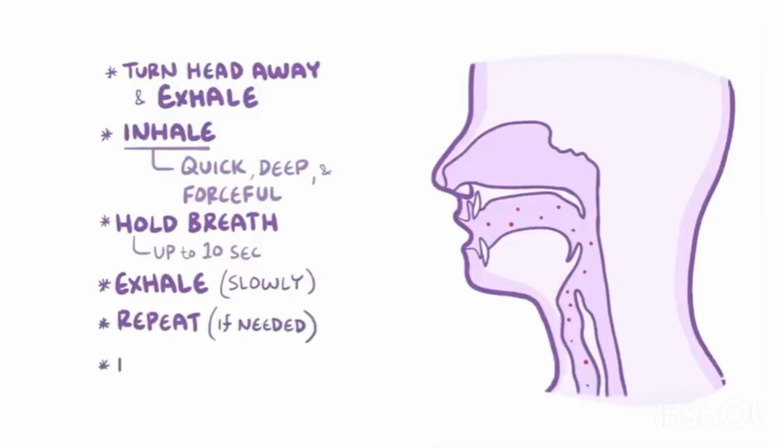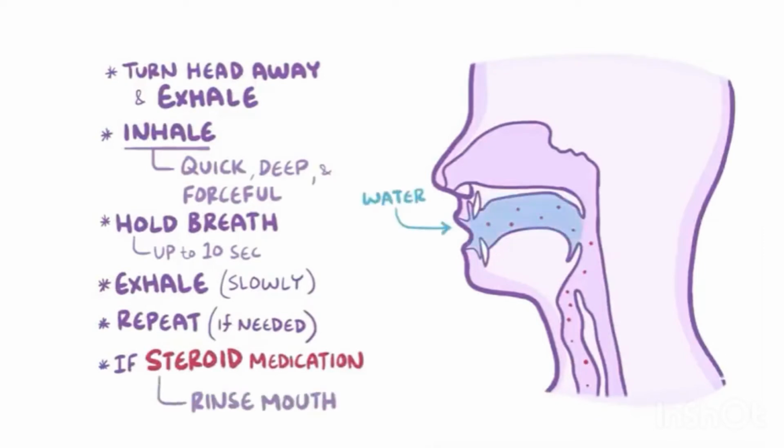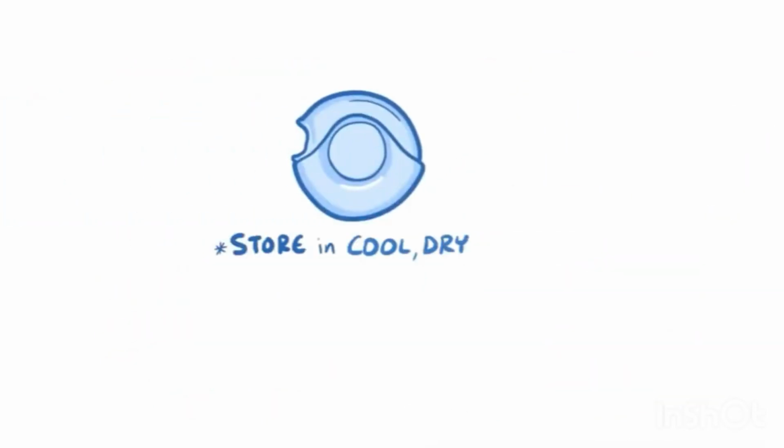And after you're done, again, if the medication is a type of steroid, you'll want to rinse your mouth with water, gargle, and then spit the water out. Also, be sure to store the inhaler in a cool, dry, non-humid place to prevent the dry powder medication from clumping.